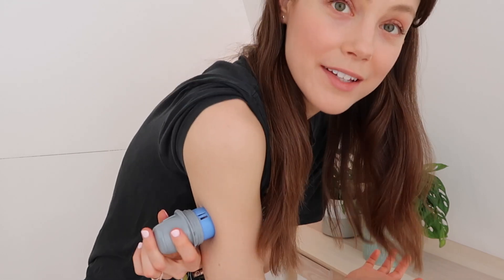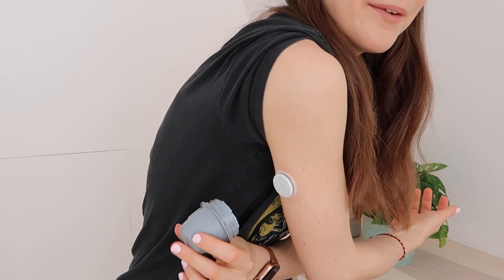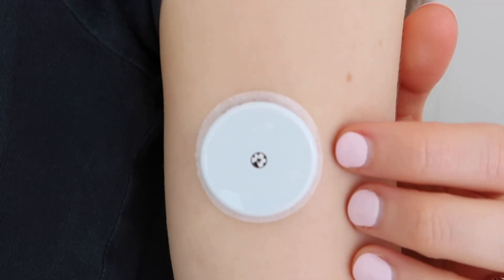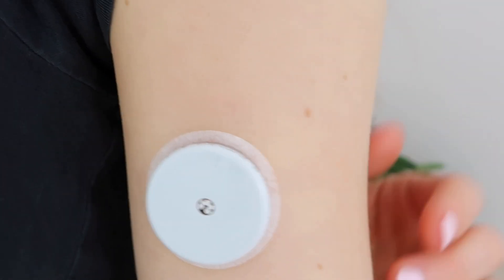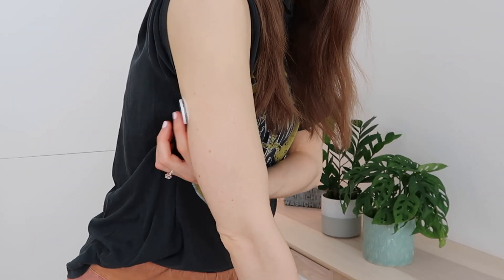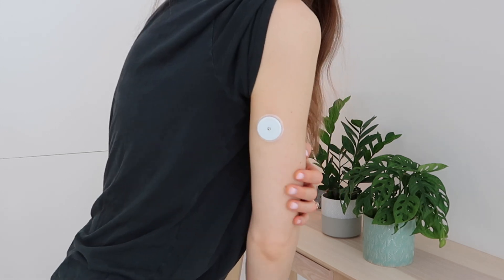I'm actually nervous — I always get nervous doing something new. Okay, one, two, three. We're in and we're off. First of all, it simply didn't hurt at all. The first ones never hurt. This didn't hurt either. The scariest thing is that snapping sound. Just to give you a closer look at the sensor: you've got the disc sitting in, doesn't hurt at all. You can see in perspective to my body how much it's standing up off the skin. That's what it looks like from the back. My sensor is on.